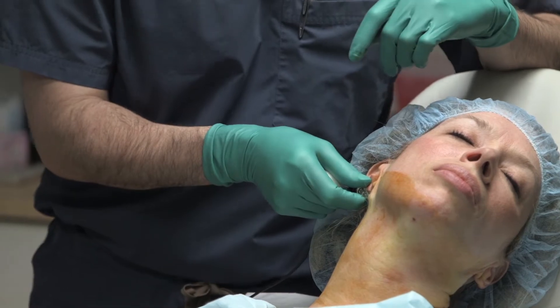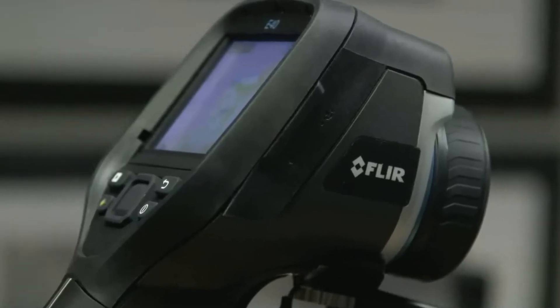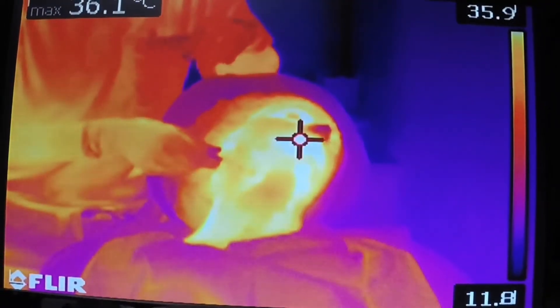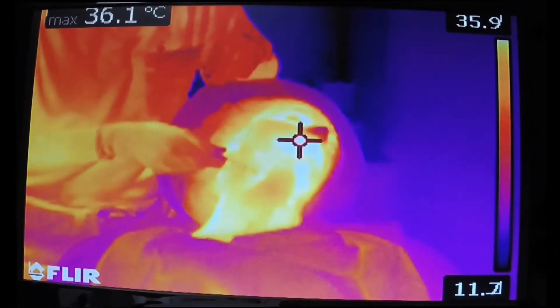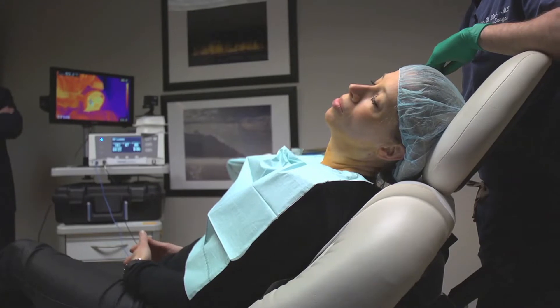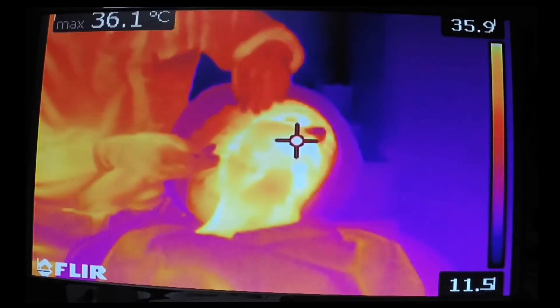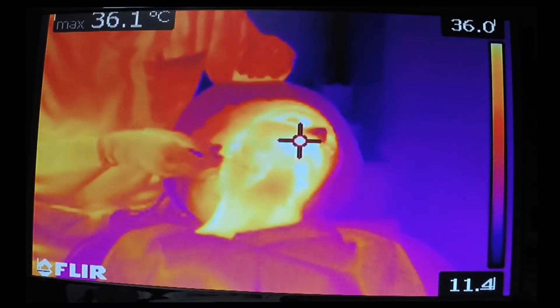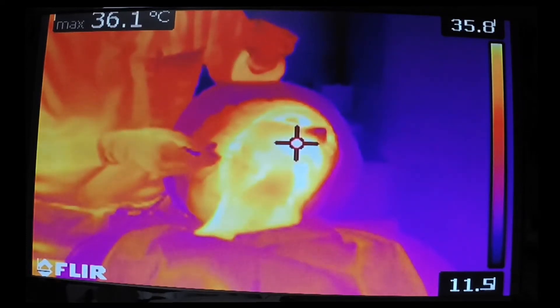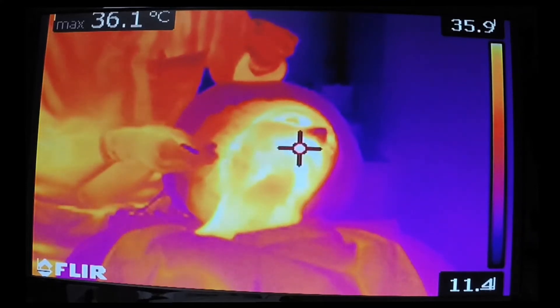During the procedure, a FLIR thermal camera is used to watch the temperature in the neck while the heat is being introduced. As you can see on this screen, we've begun to start the procedure from the right lateral neck. There is a crosshairs that shows up on the FLIR screen which measures the temperature of the neck at about four times per second, and this crosshair flies to the hottest part in the neck.